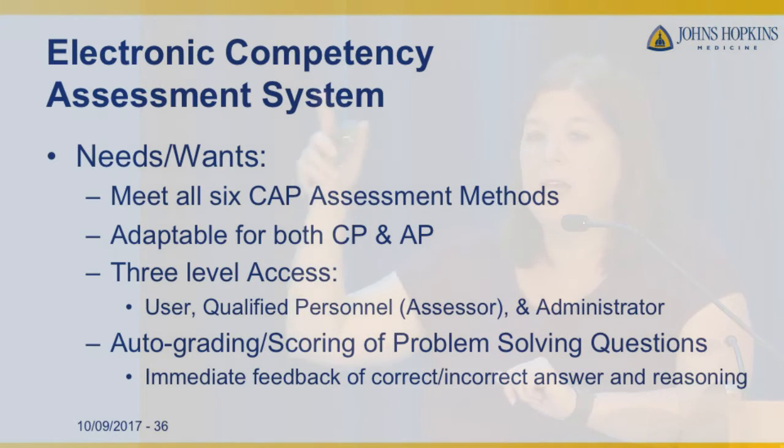Then you have more of a reviewer that can see everybody's competency in your division, so you can keep track of everything. This would be the person reviewing the problem solving, questions, blind samples, things that are beyond that direct observation category. And then you also would have somebody maybe in administration overseeing competency for your whole department, to see that everybody has finished and that things are all in the same kind of format.